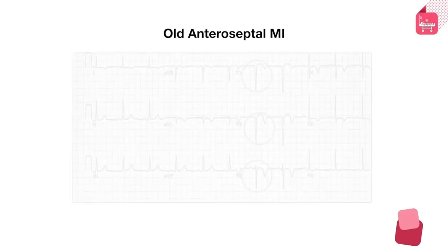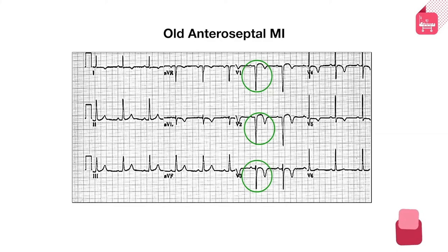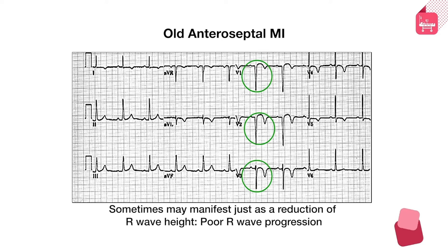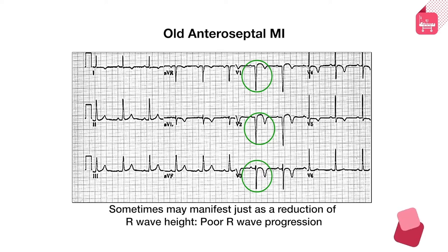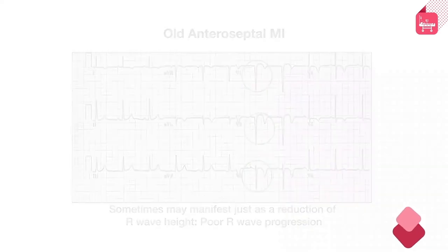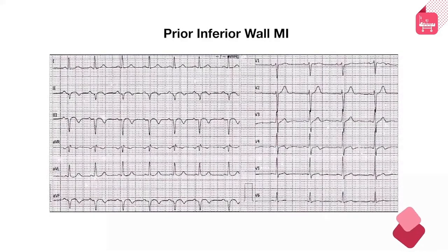This is an example of an old anteroseptal MI. You can see the Q waves circled in green in V1 and V2. In V3 there is no complete Q wave due to a small positive R wave. With smaller infarcts, a complete Q wave may not develop; instead, there is just a reduction in R wave amplitude — referred to as poor R wave progression — which should also be kept in mind.